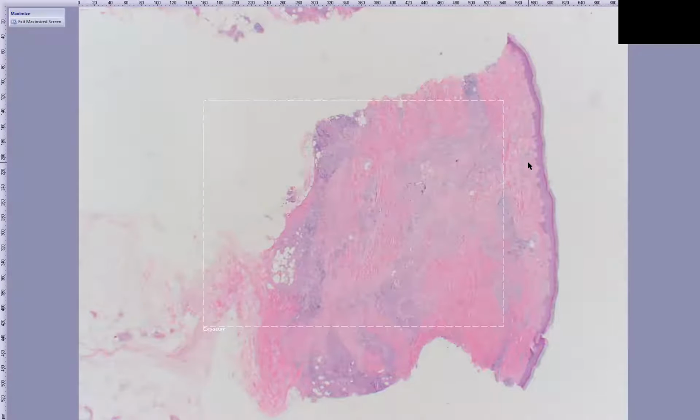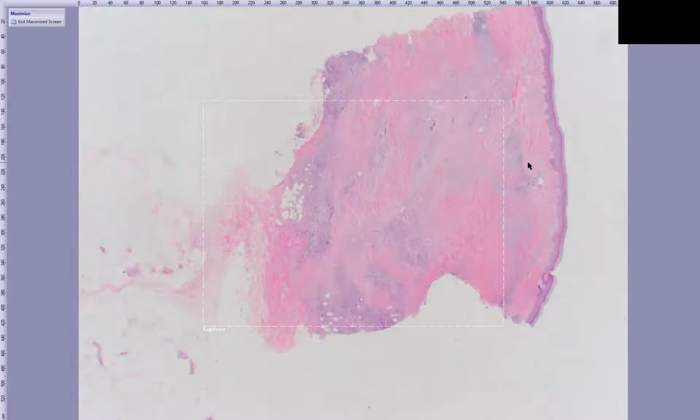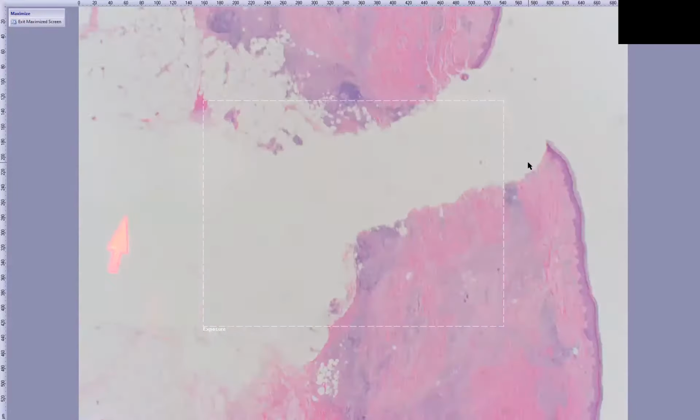So you'll see a fairly diffuse, dense infiltrate that's equally dense through the dermis, or it might be mostly in the dermis and not so much in the subcutis. You might have just a little bit of minimal extension into the fat, kind of similar to what we're seeing here. And it tends to be the portion of the dermis that dips down to form the panniculus septae that is involved. The inflammatory infiltrate, when you look at it, tends to be arranged in a vaguely horizontal fashion, is the way I like to describe it. It looks like the tiers of a cake.